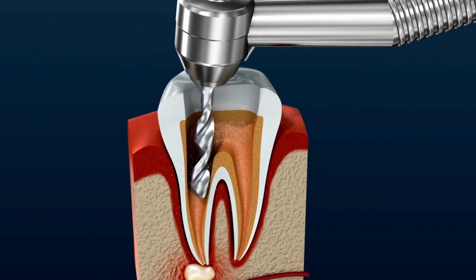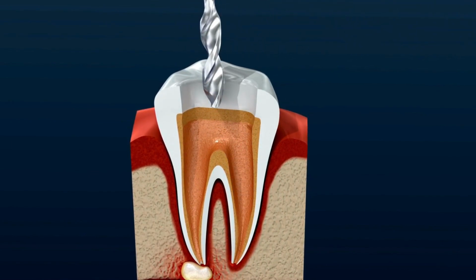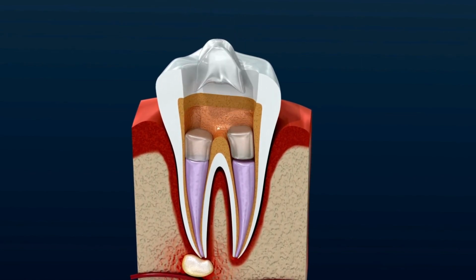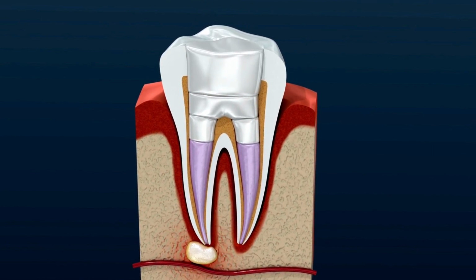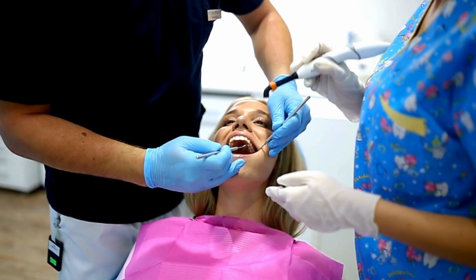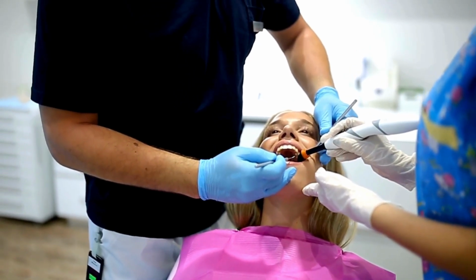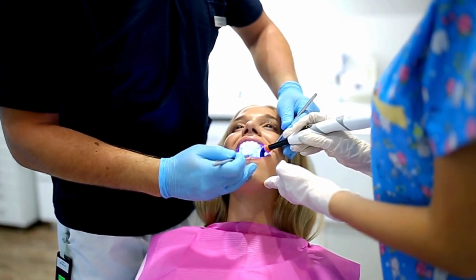Sealing of root canals. For this, a conical tipped rubber material called gutta percha is inserted into each of the canals and glued into place, usually with cement. Sometimes, a metal or plastic rod may also be placed inside the channel for structural support. In this procedure, at least 2 radiographs are taken from the tooth. In some cases, this number may increase.